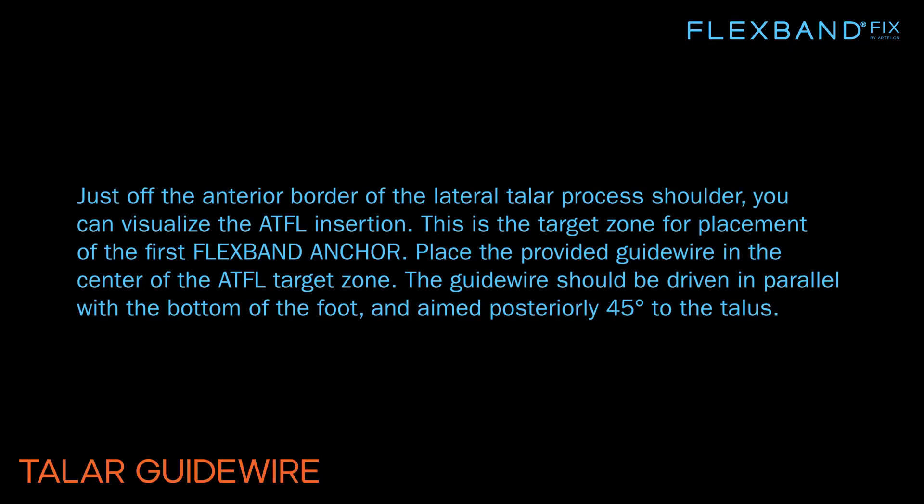Just off the anterior border of the lateral talar process shoulder, you can visualize the ATFL insertion. This is the target zone for placement of the first FlexBand anchor.